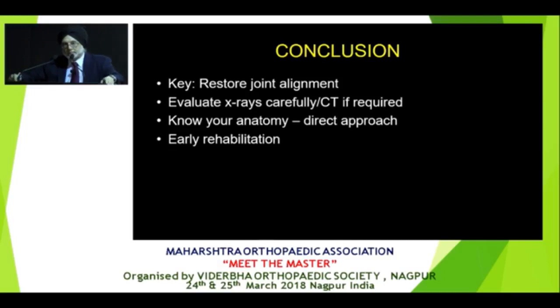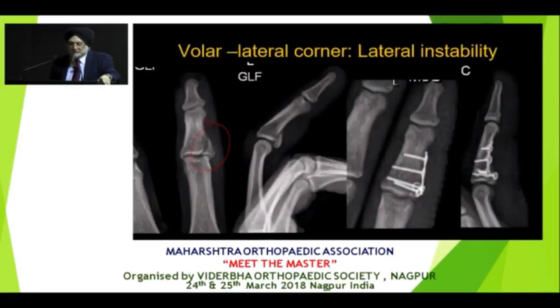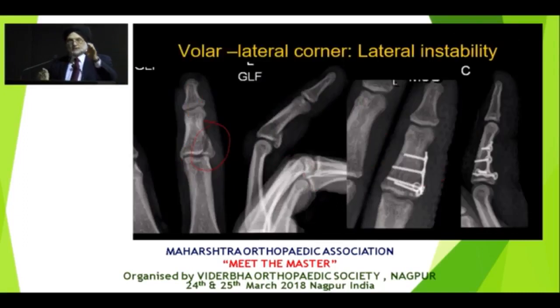Sir, sorry for the mediocrity, but for the lateral corner fracture, couldn't it be reduced closed and then fixed with 0.8 millimeter or 1 millimeter K-wires? Oh, for sure. It's not mediocrity. I think it's doing whatever works best in your hands. For example, a fracture like this, you could put K-wires, but the problem with K-wires is you don't get compression and you can't move them early. But it's perfectly reasonable to treat that fracture with percutaneous K-wires, put them in a splint for 3 weeks, remove the K-wires and start mobilization.